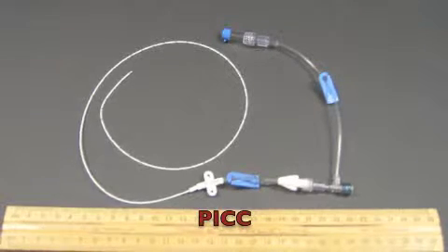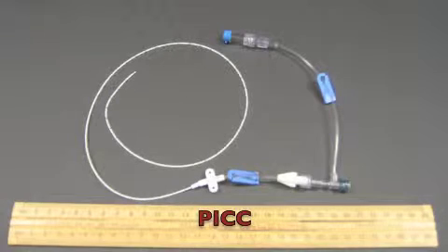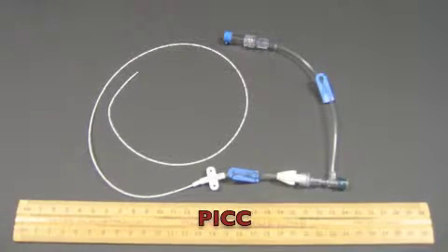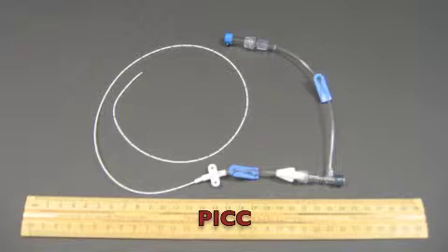PICCs are long-line catheters inserted in the antecubital area and advanced into the central vessel. They are placed peripherally, but deliver medications and solutions centrally. These can also be used for long-term or intermediate therapy at the hospital or at home.